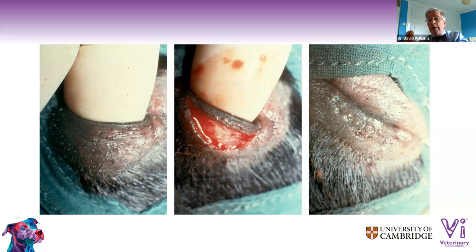And then that means that when you decide how much to take off, if you had gone double that distance from the edge of the lid, then when you took off your little ellipse of skin, the skin that you've got left right at the lid edge would widen, and it's much more difficult to work out exactly how much to remove. So remove a little ellipse of skin.